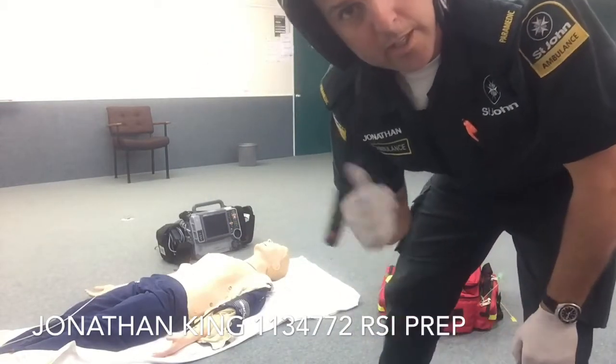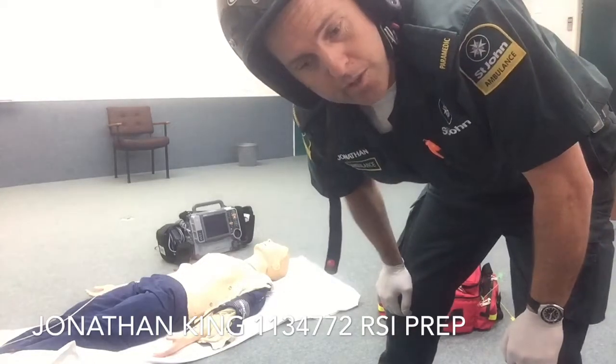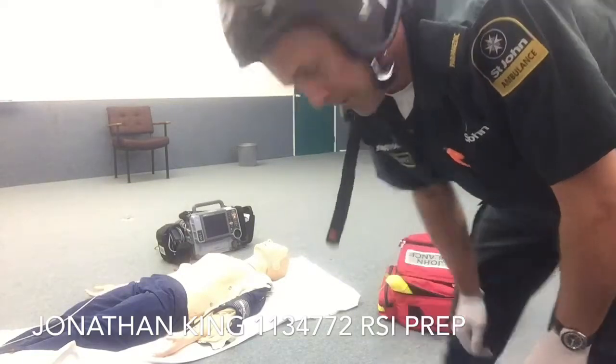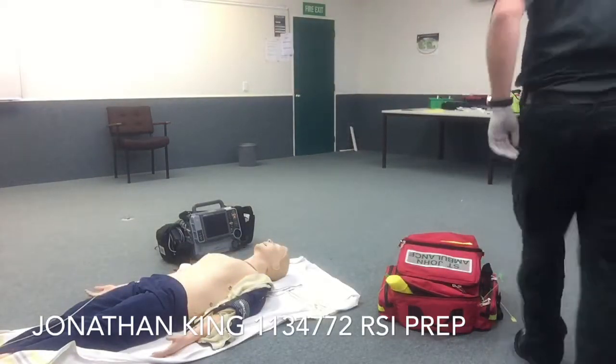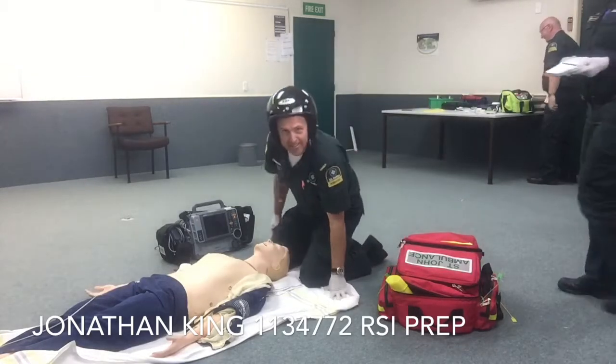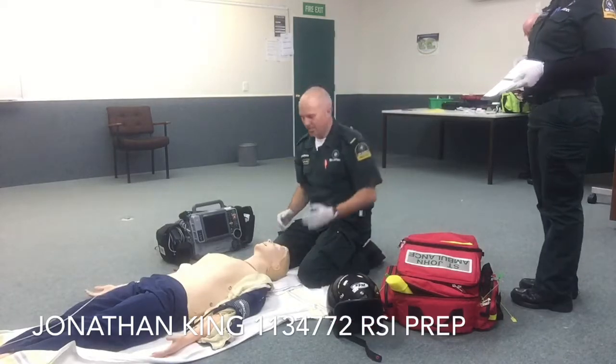Here we go. So we've got a suspected head injury here. We're just going to go through the paces and call for RSI and prep for RSI. So I'm going to go through. Where do you want me? This is my lovely assistant Joe.